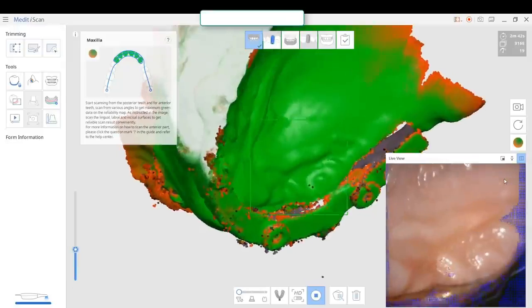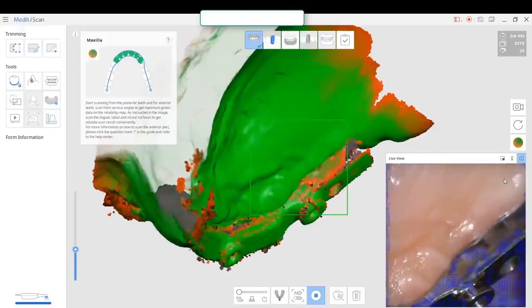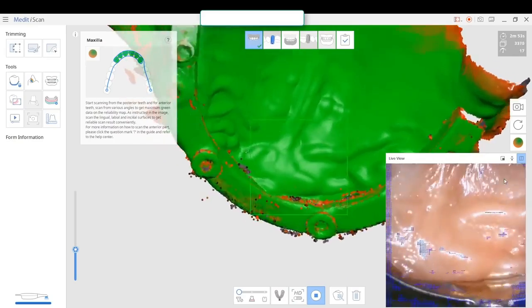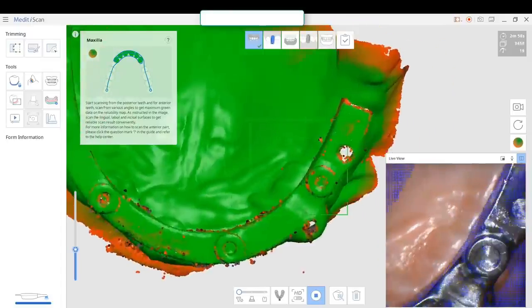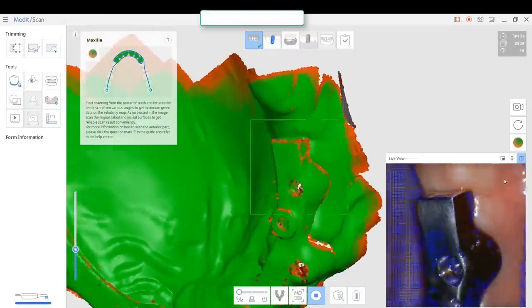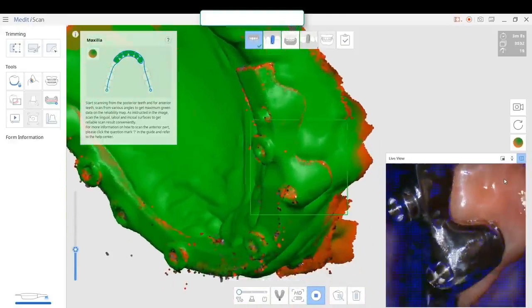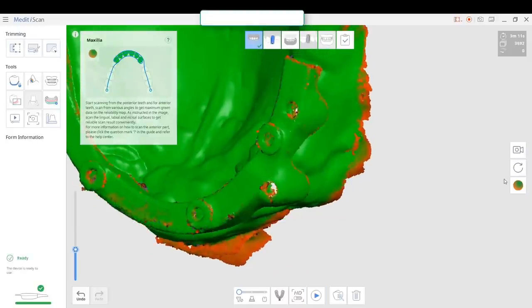Now, with the new software, I image the same case. There's a specific feature for scanning metal that you activate, and you'll see how much faster this is. But it's important that you understand the way I'm imaging, the focal length I have it set, and what I'm doing and what dictates the pace I image with. So it's about 3 minutes so far into this, and you can keep angling it to fill in every area that has deficient data if you wanted to for whatever particular reason. So now we'll process this and we'll try it out with the beta software.